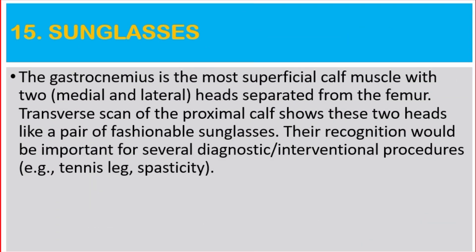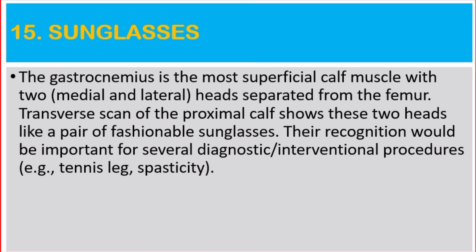Number 15: Sunglasses. The gastrocnemius is the most superficial calf muscle, with two medial and lateral heads separated from the femur. Transverse scan of the proximal calf shows these two heads like a pair of fashionable sunglasses. Their recognition would be important for several diagnostic and interventional procedures, for example tennis leg and spasticity.